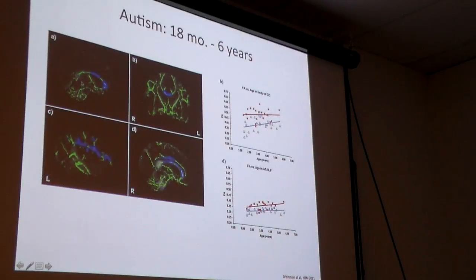And what it's actually doing here, the green is just showing you what it calls the white matter skeleton. It's just the center of all of the areas of white matter. And then it maps the measures, the FA, MD, things like that, onto that skeleton to allow statistical comparisons between groups. So it allows you to align all of your subjects to a single space that's based on that skeleton.